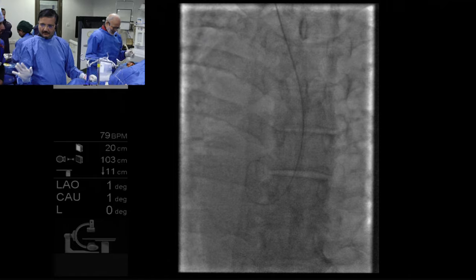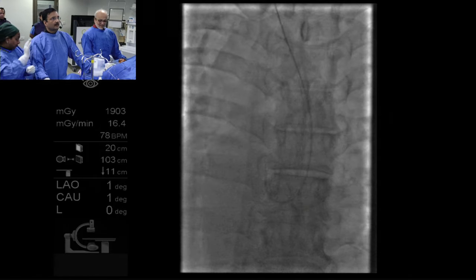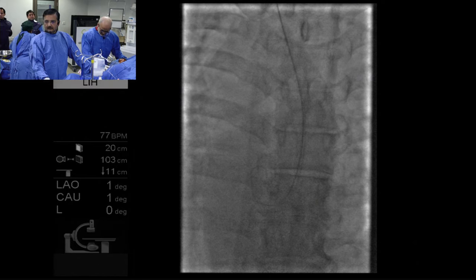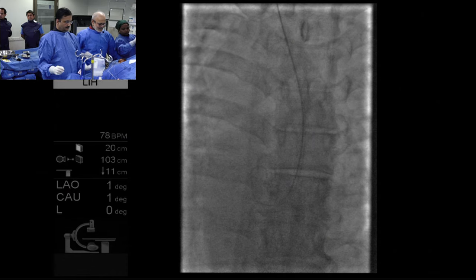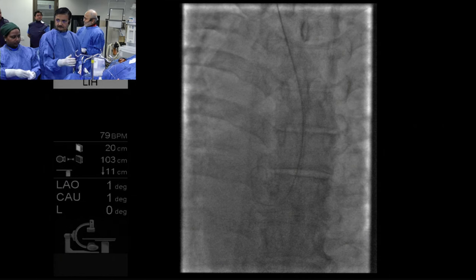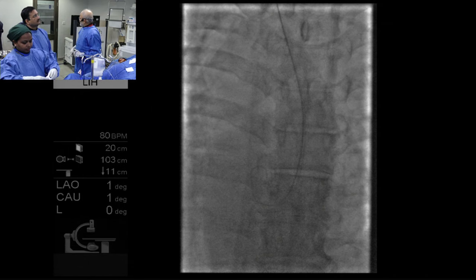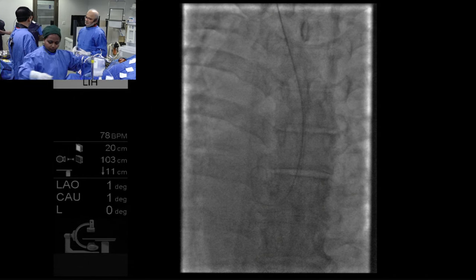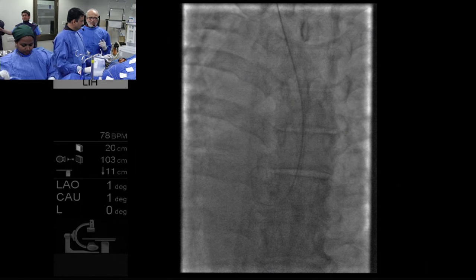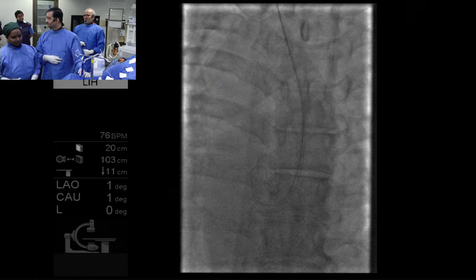My default guide catheter for right coronary interventions is an Ikari right, and so I would use it in this case as well, having never done a PCI in dextrocardia before. What's your choice, Rajiv? Ikari. Rajiv will use Ikari. And you, Professor Patwari? Right Judkins. We are going to use, me and Sanjay have decided to use a hockey stick. Six French.